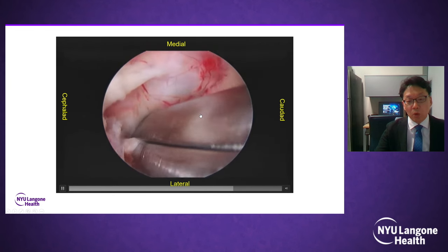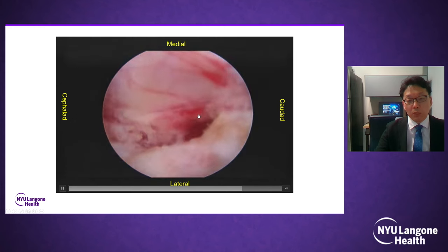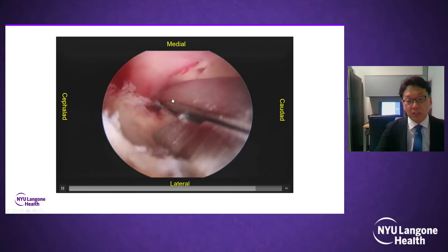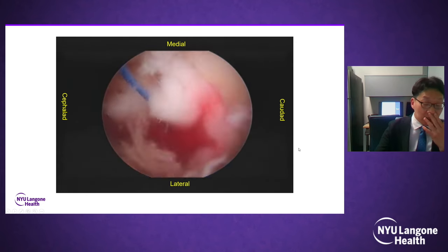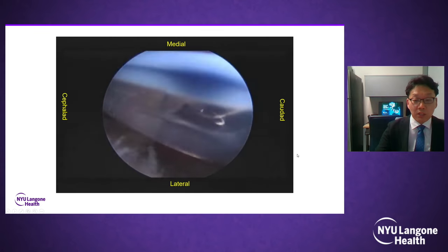The C6-7 level was just foraminal stenosis. After foraminal decompression, surgery was ended. There is a freed root. The end point is when to end. It is important when to end the foraminal decompression.